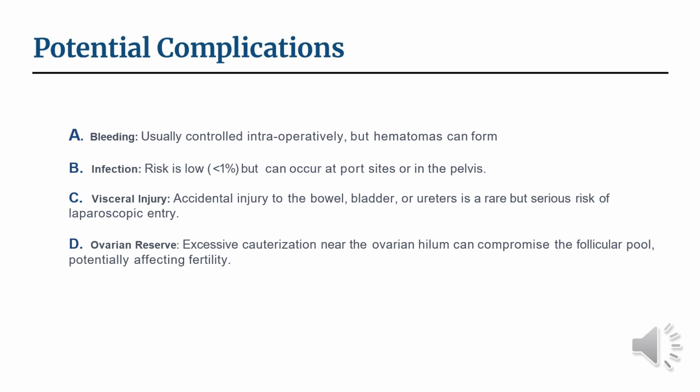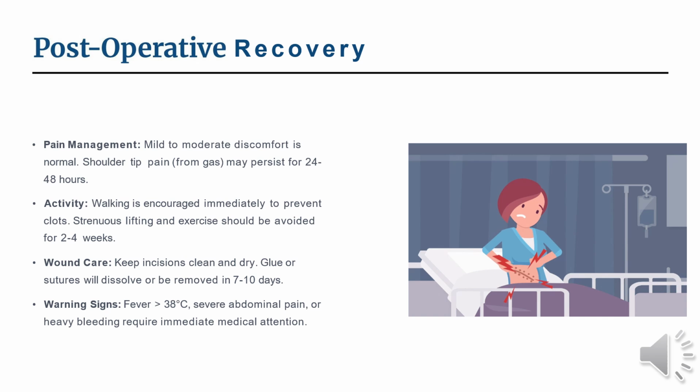Although rare, complications can occur. These include bleeding, infection, and visceral injury, particularly during the initial laparoscopic entry. Additionally, excessive cauterization could impact ovarian function and could affect fertility.